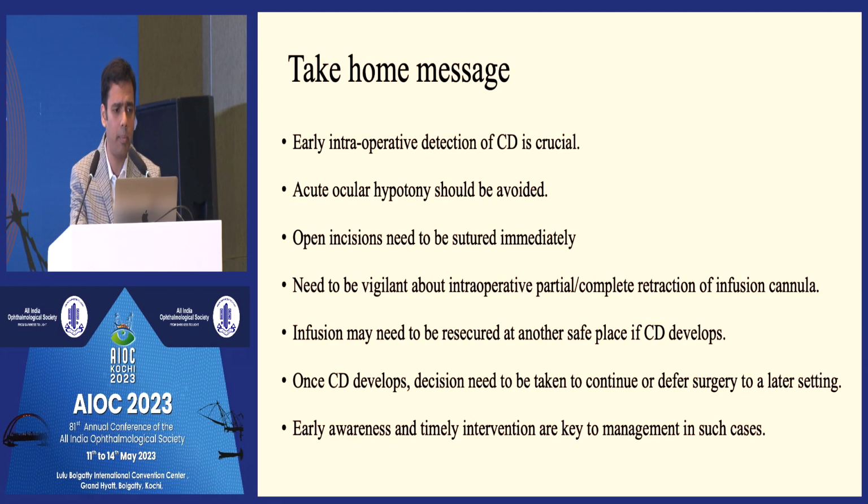So early intraoperative detection or awareness that the choroidal detachment has happened is crucial. We need to avoid acute ocular hypotony. If there is any open incision, we need to suture it immediately. Need to be vigilant about intraoperative partial or complete retraction of the infusion cannula, and it may need to be resecured at another safe place if CD develops. Once CD develops, a decision needs to be taken to continue or defer surgery to a later setting. Early awareness and timely intervention are key to management in such cases.